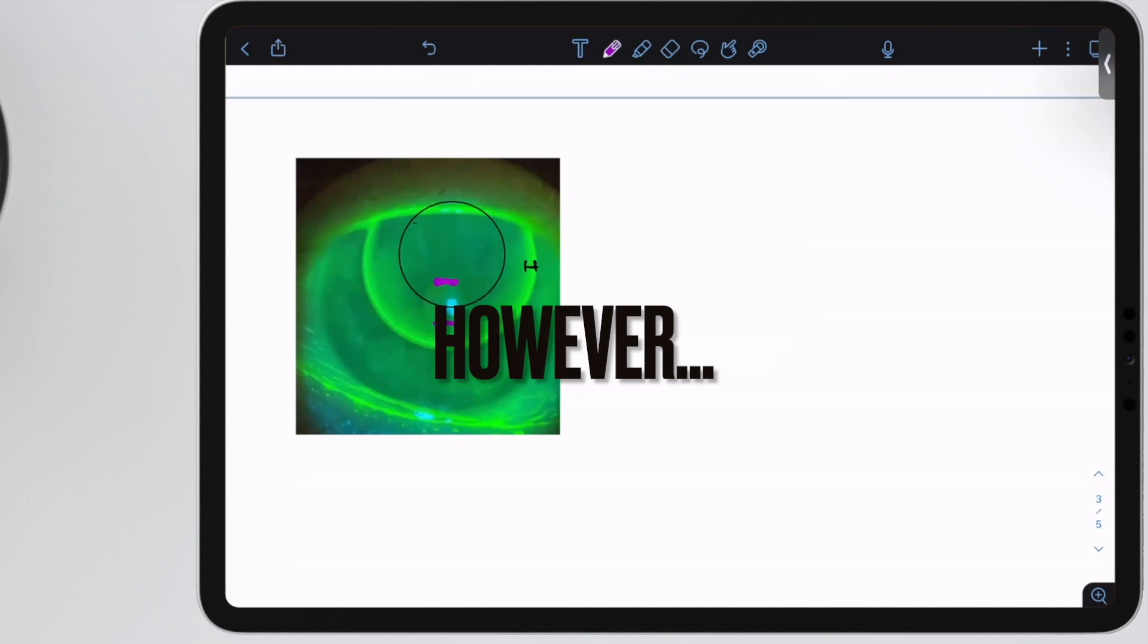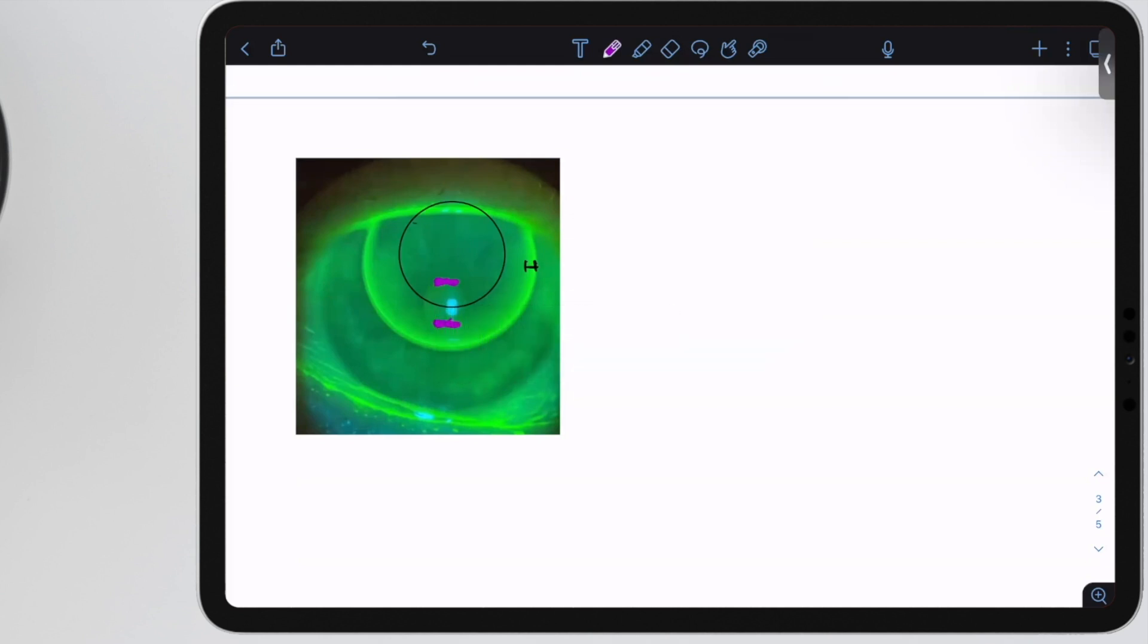This patient's pupil is looking through the optic zone but also through the peripheral curves. This patient is going to experience where half of the image is clear and half looks like a smudged eraser across it. This lens is too small, making it ride really high. You want to make it larger to help it center better on the eye, so you'll increase the diameter.